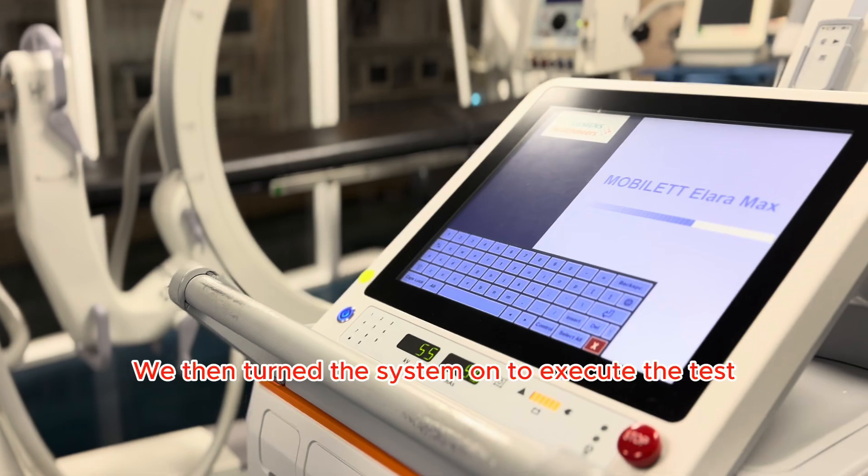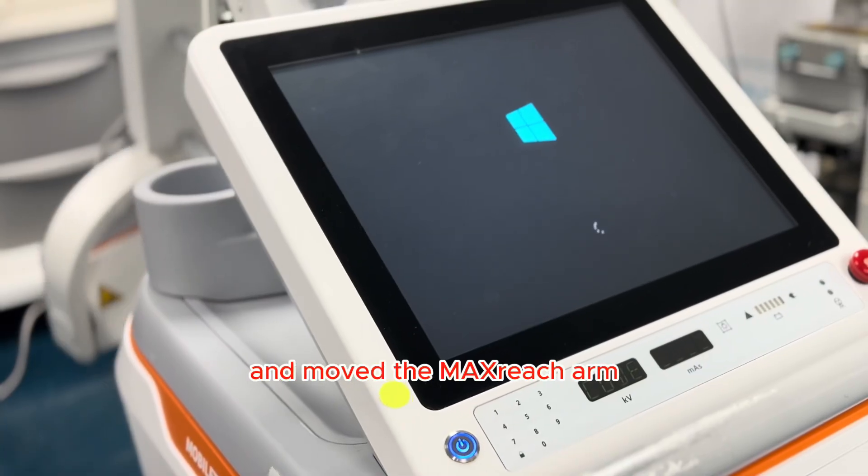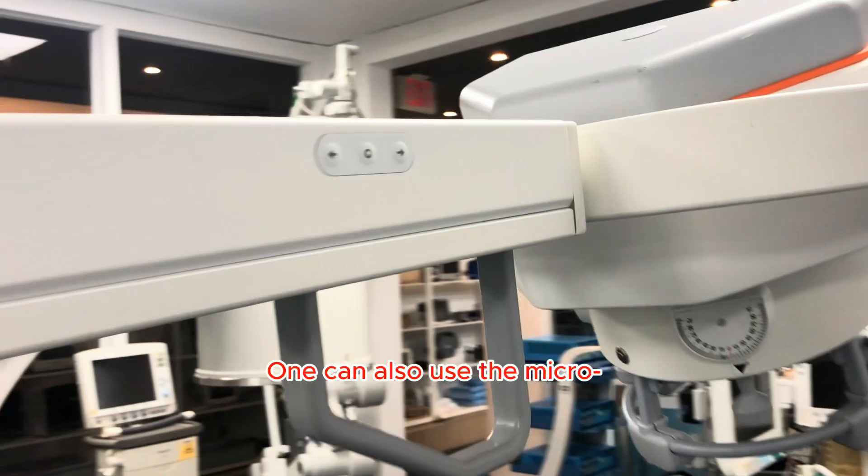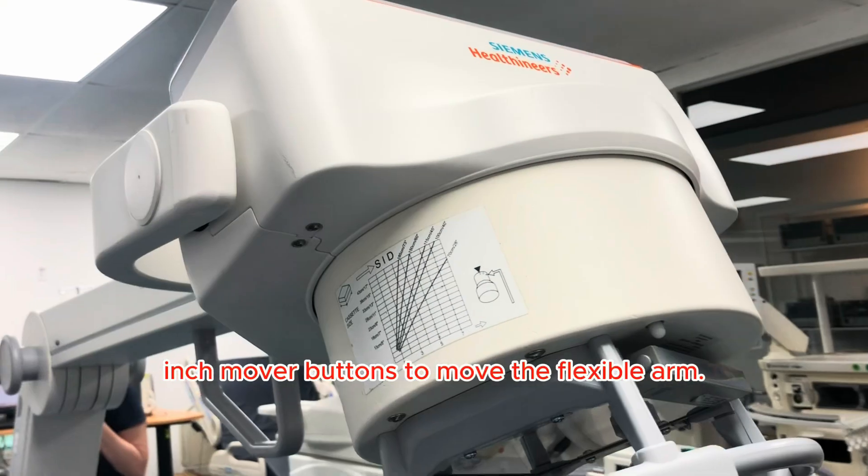We then turned the system on to execute the test and moved the max-reach arm where we thought it'd be best for the test. One can also use the micro-inch mover buttons to move the flexible arm.